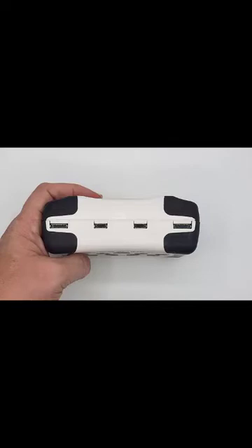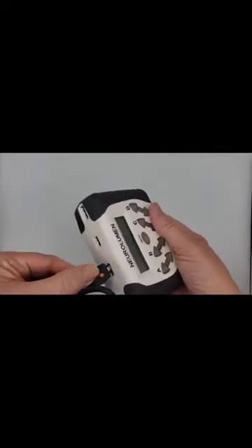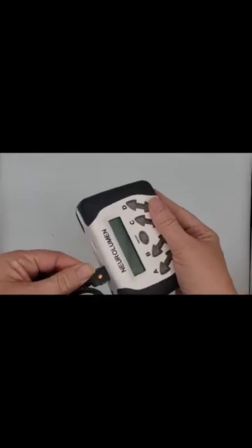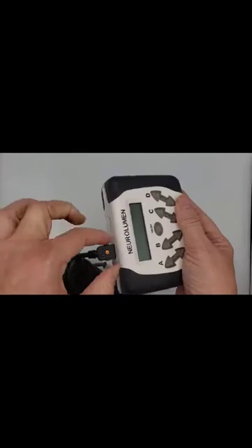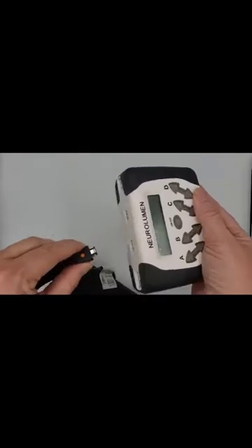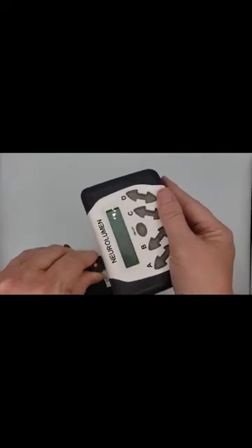You will use the connector to plug the treatment pad into your unit, orange dot up. On the top of your unit, there are 4 ports that are 2 different sizes. There are 2 ports for the single treatment pads and 2 ports for the dual treatment pads. When plugging in your treatment pads, you will put the orange dot up and hear a little click when it is securely plugged in. To remove the treatment pads, you will pinch the side and gently remove it. Depending on your order, you may use one or all 4 ports.